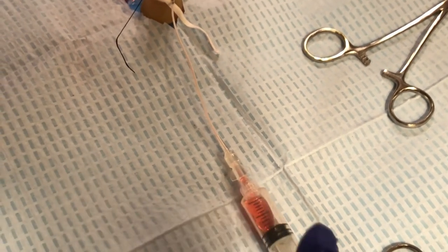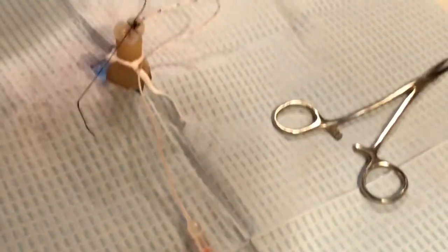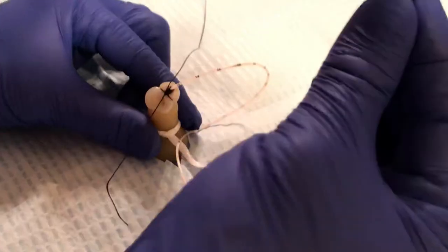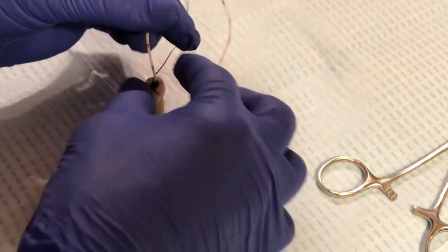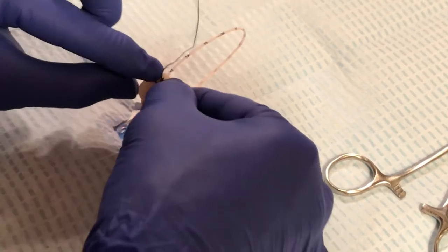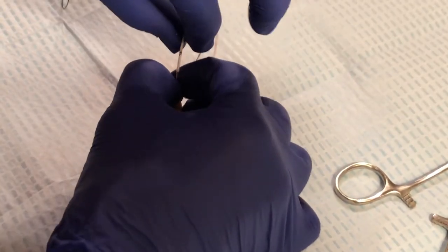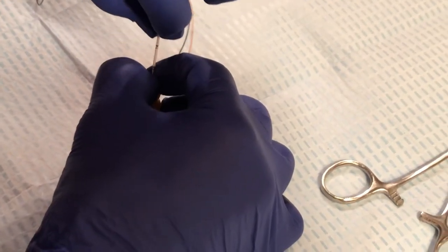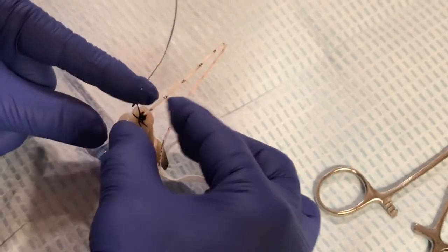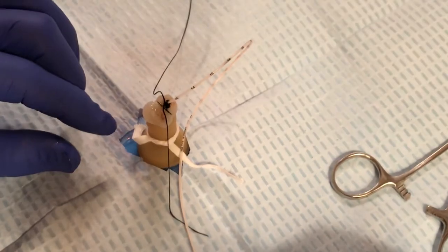If the catheter needs to be pulled back — say one centimeter — the best way is to first take your first hand and tightly secure around the base where the sutures are, almost pinching the catheter. Then use your opposite hand to pull the catheter back to the desired position, say one centimeter. This serves as a safety mechanism so that if the catheter pulls more abruptly than expected, you have your fingers at the base to grab hold.